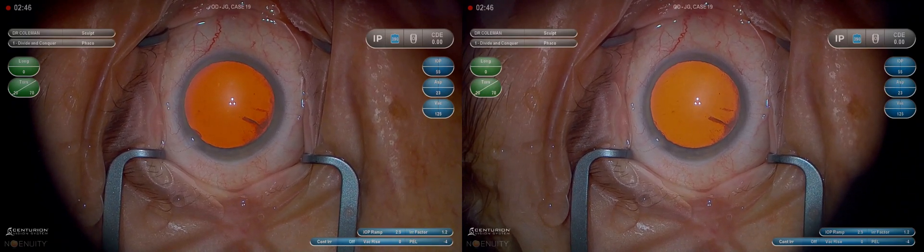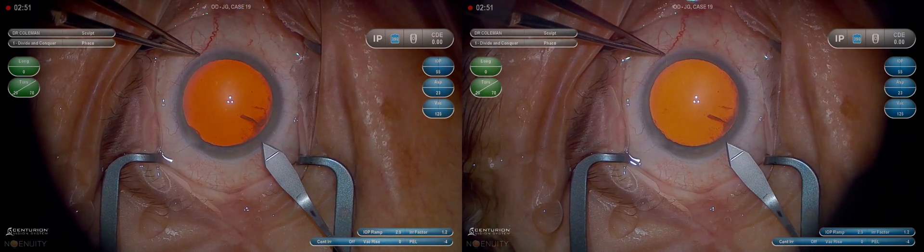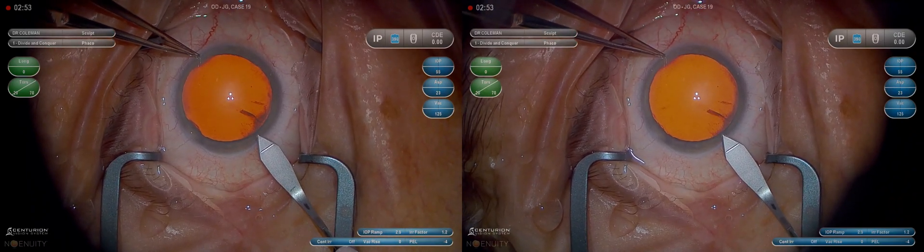Now the main wound starts 0.5 millimeters anterior to the limbus. We want to make sure that we don't push it down when we're making our main wound, because that can track back into conjunctiva.